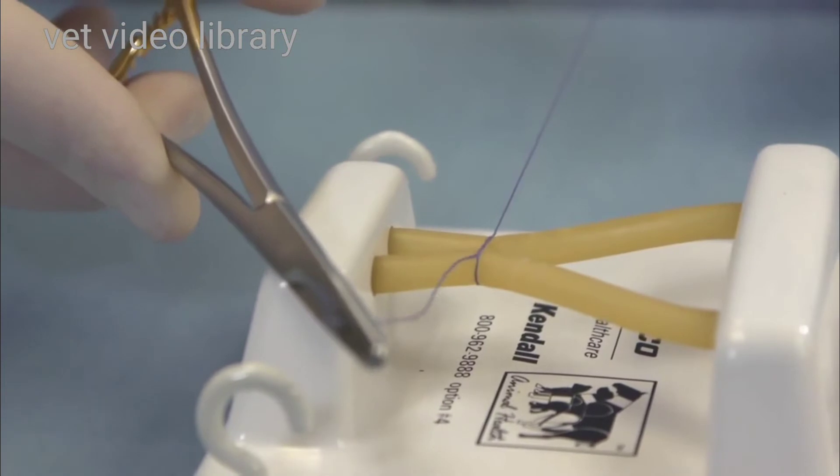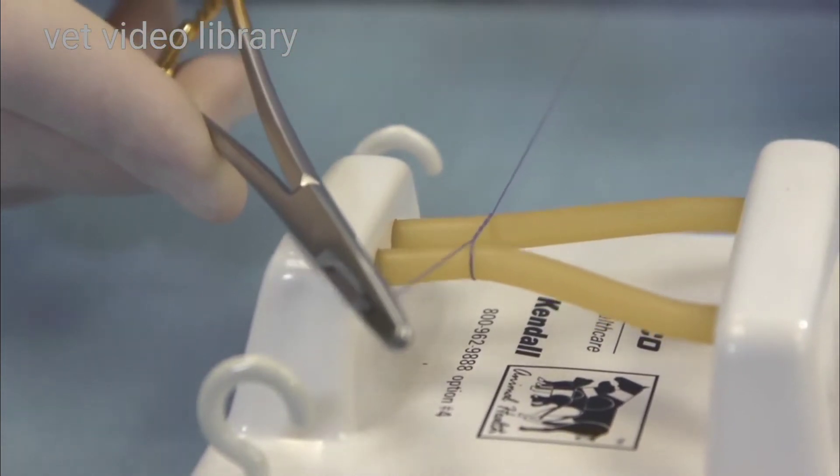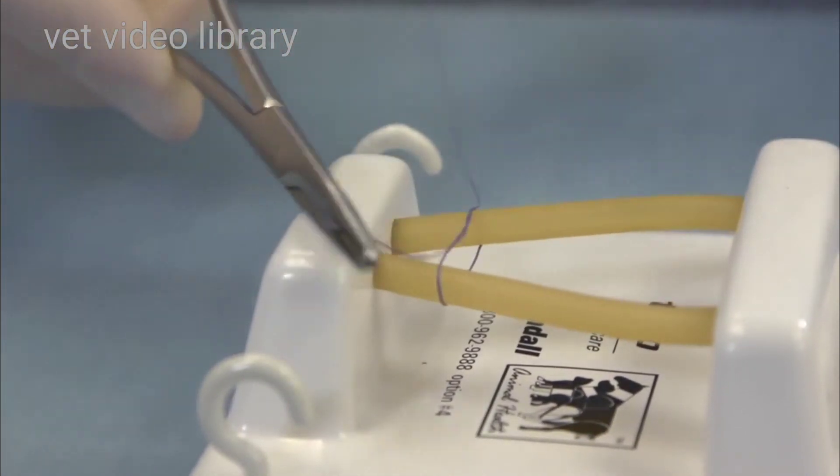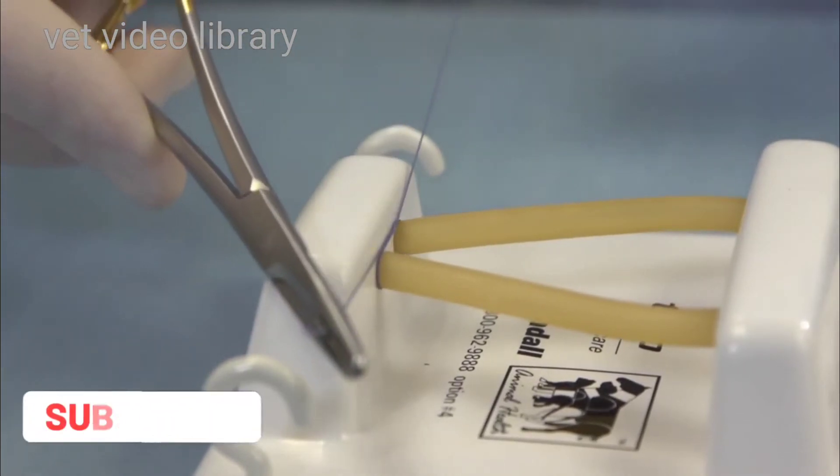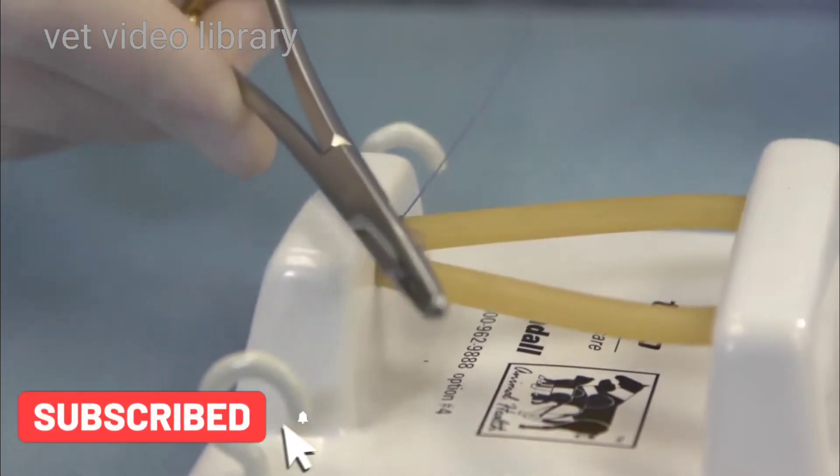This may be adequate depending on the amount of tension. As you can see here, that is not adequate. If we move this down into less tension, that's still going to be inadequate. So we need an alternative.